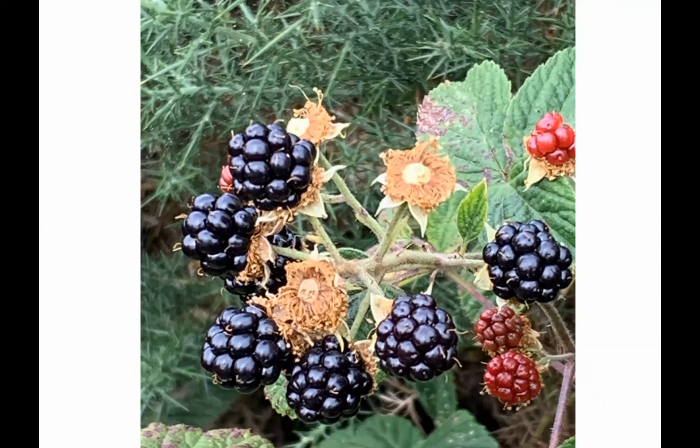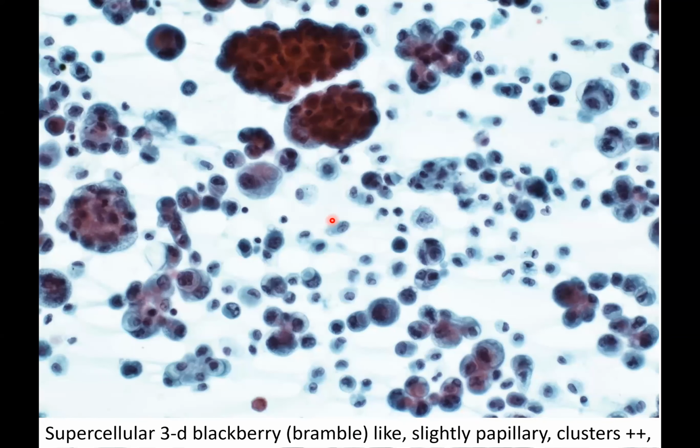And this is what brambles look like. I'm afraid this supercellular cluster would have been more so had I not eaten 2 of the brambles prior to taking a photograph. On the PAP, again, you see these blackberry or bramble-like clusters in an overall supercellular background with single abnormal-looking mesothelial cells in the background. Some of them are vacuolated, some are clasping.